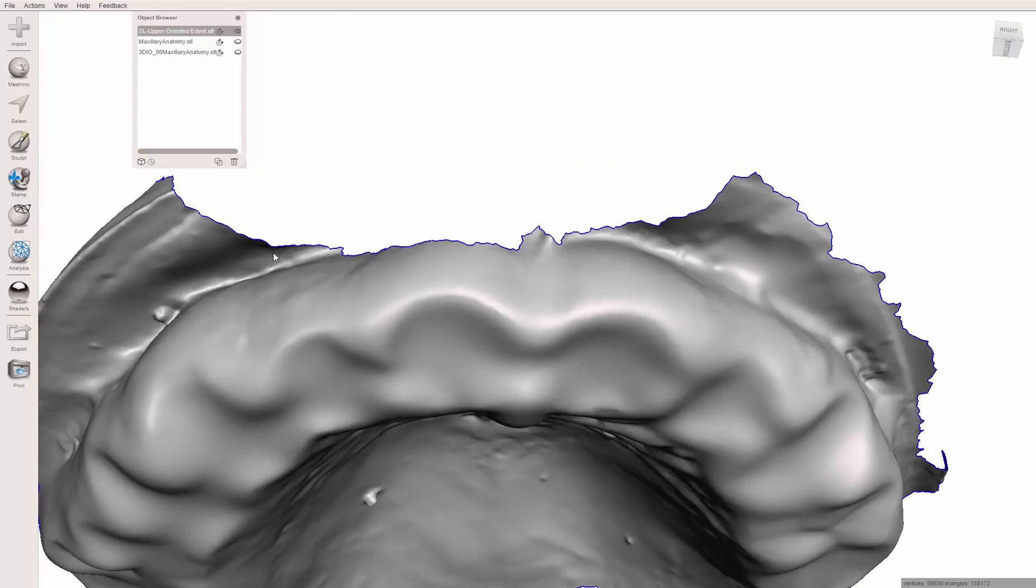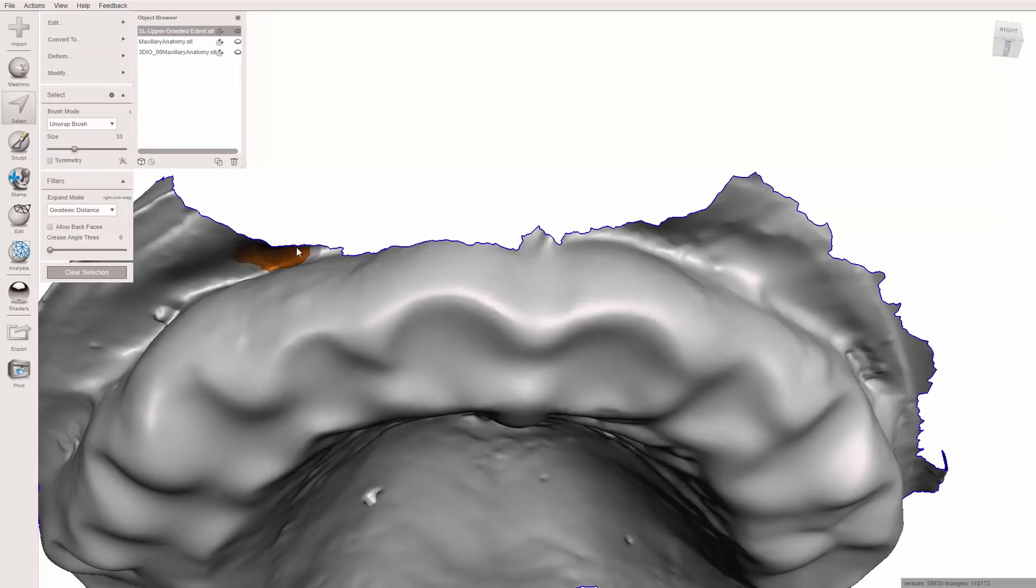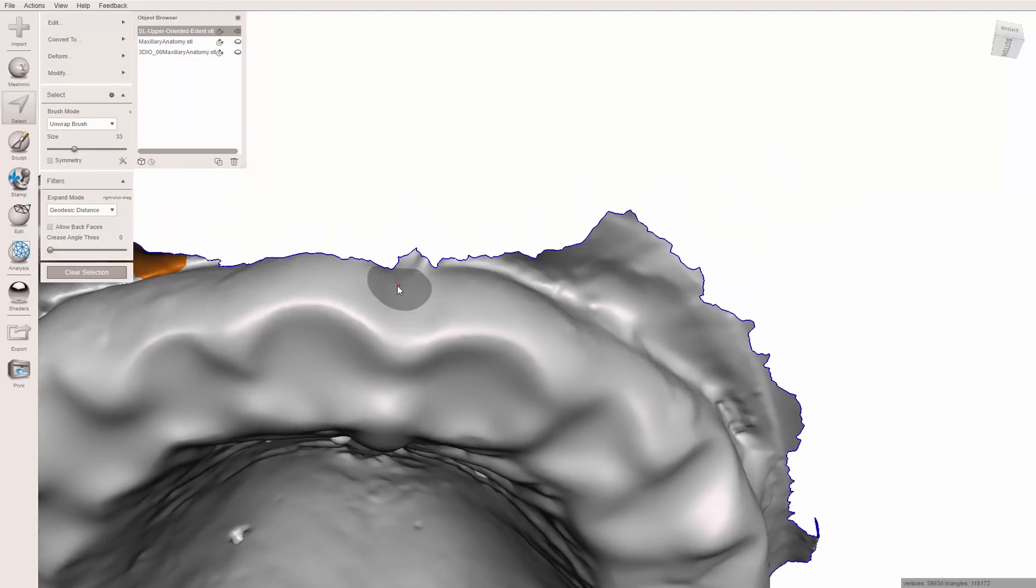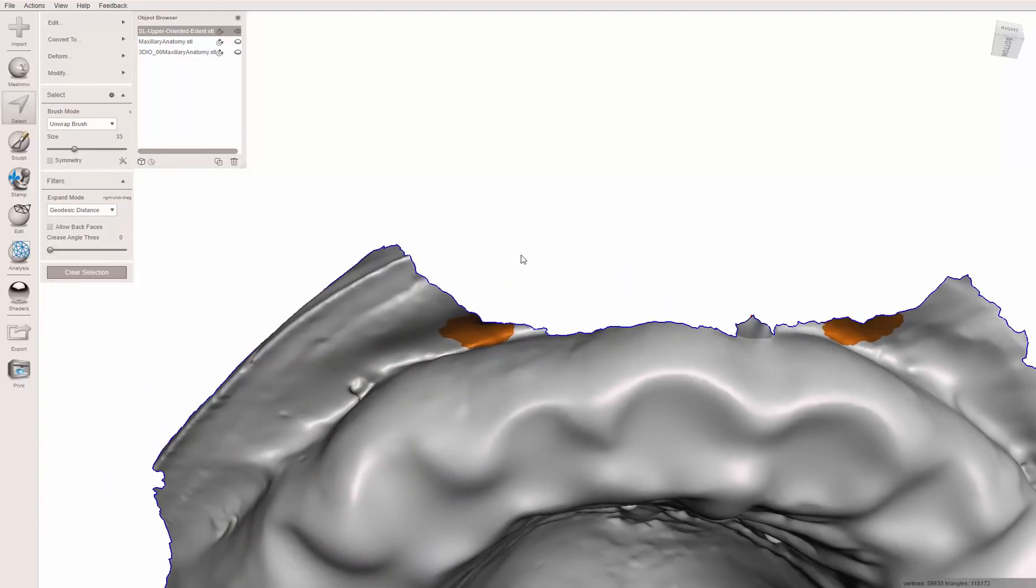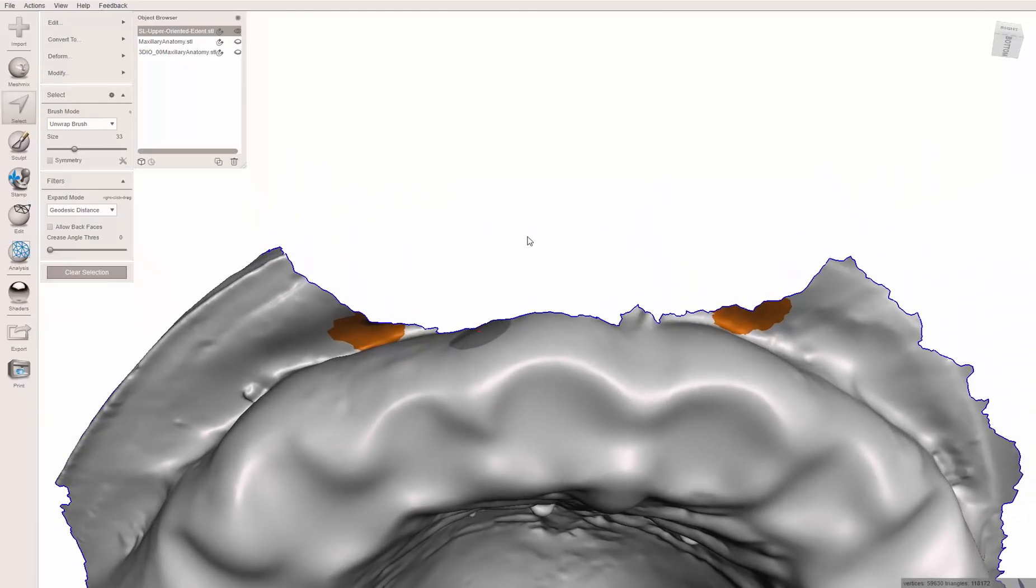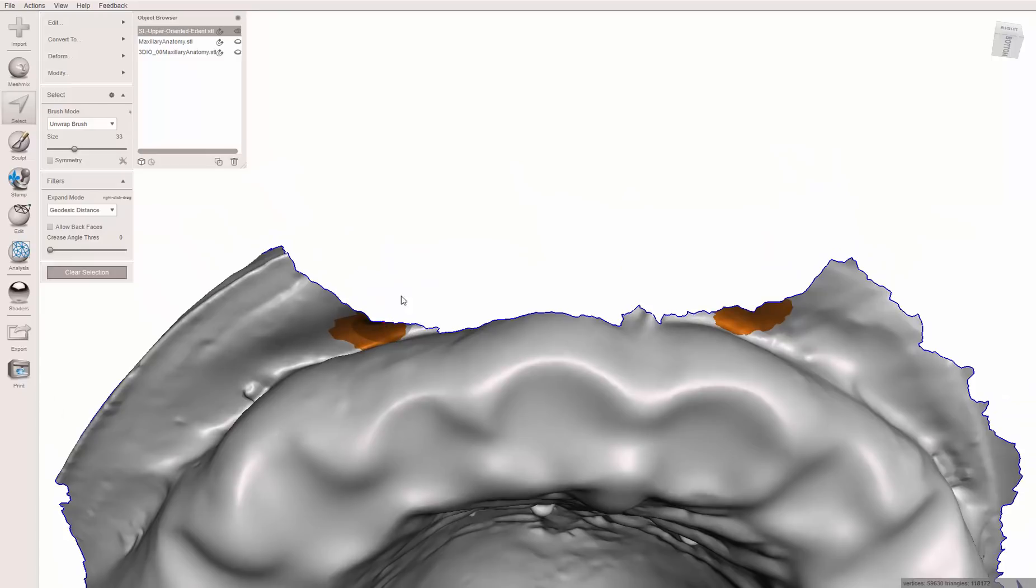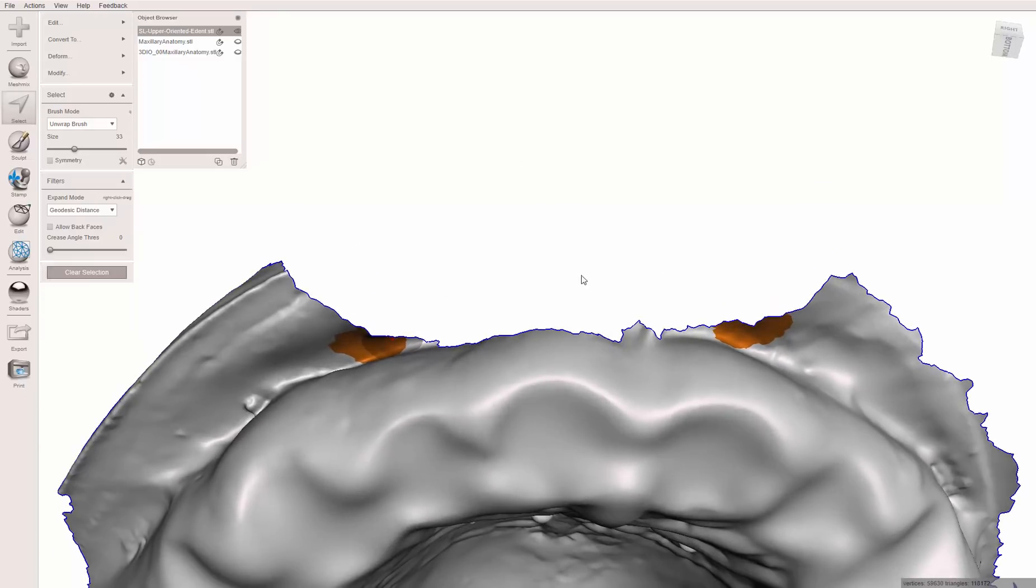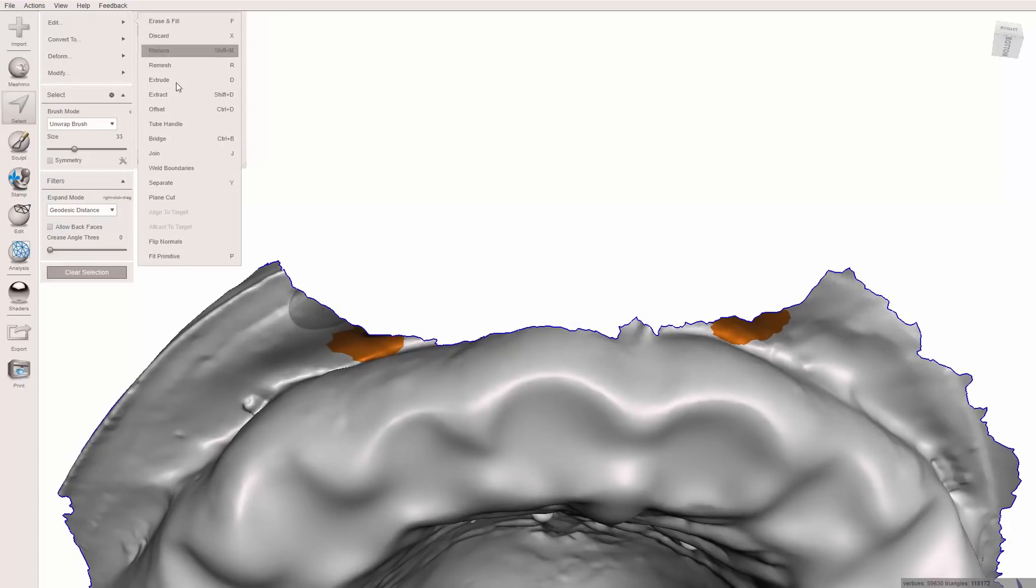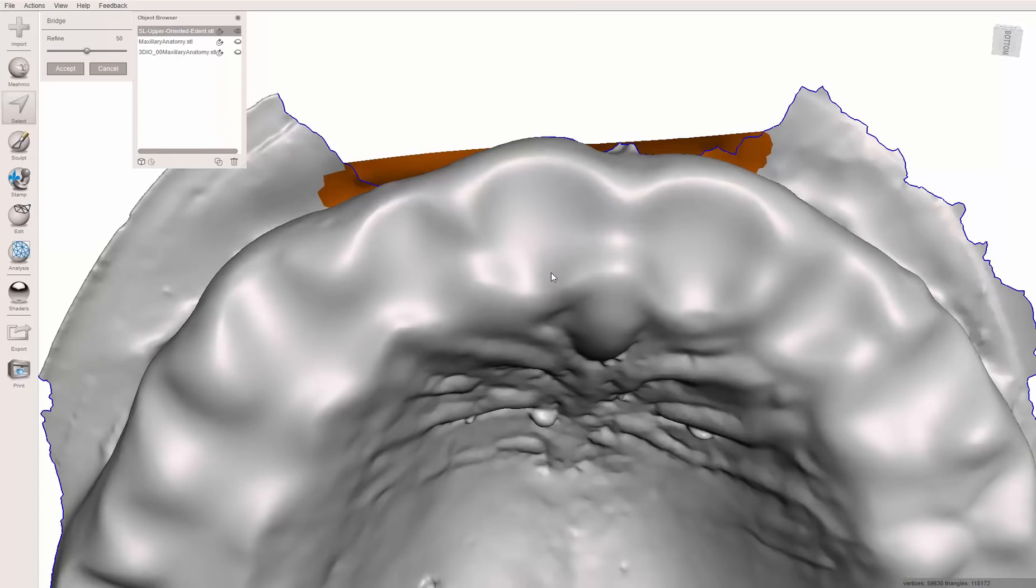So what I'm going to do here is hit the select tool, and I want to call out Nathan, Dr. Nathan Farley. He's actually the person that brought this tool to my attention. I had never even noticed it was there and then a while back he mentioned it in a video of his and now I use it quite a bit. I've selected these two areas and what I'm trying to do is bridge the gap. I'm going to try to create a piece of material that connects the two of these. If I come to edit and bridge, also control B is the shortcut, if I click right there, it creates this bridge.